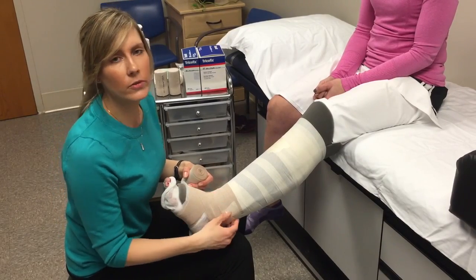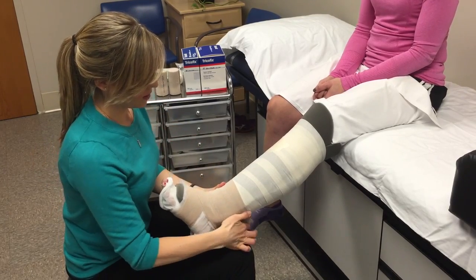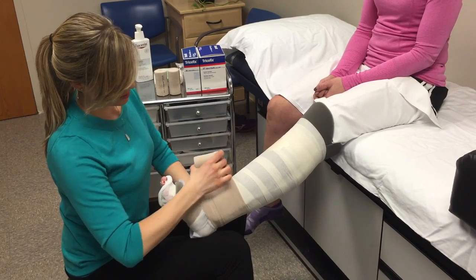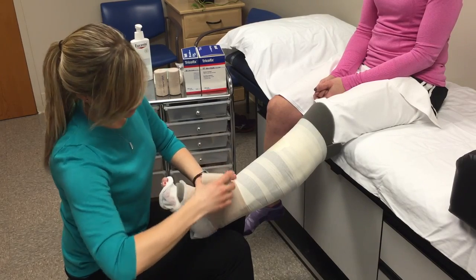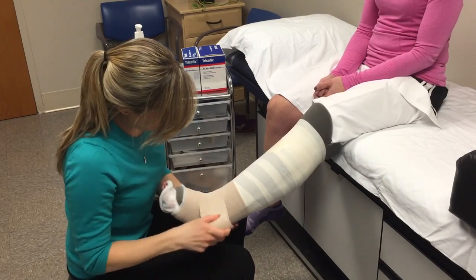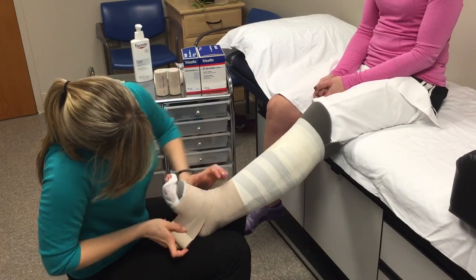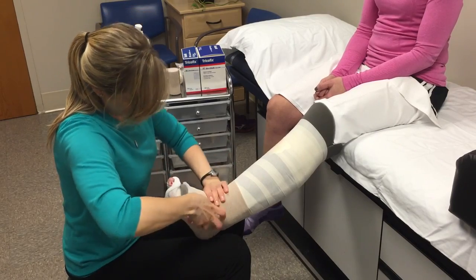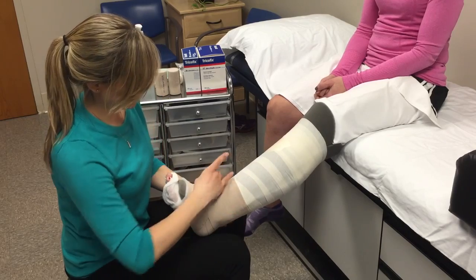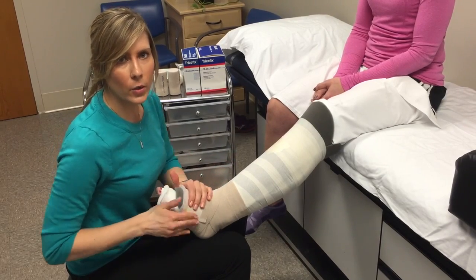Once you've finished with the first bandage, secure it with masking tape and move on to the next bandage. Again anchor at the ankle, making sure not to pull too tightly, smooth it down. Now we're following a pattern that goes from the heel to the ankle to the sole. Come down, cover the heel, smoothing as you go, back around the ankle. Remember to keep the foot flexed, and now down to the sole. You're trying to cover the entire foot, and always make sure you're asking the patient how they feel. Once you've repeated the heel-ankle-sole sequence and run out of bandage, secure it with masking tape.